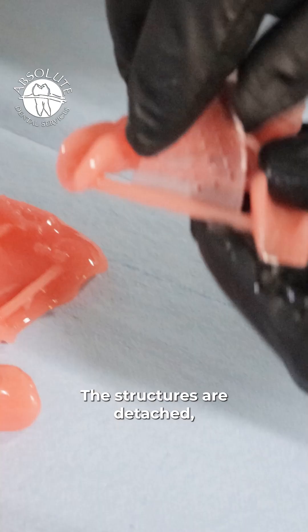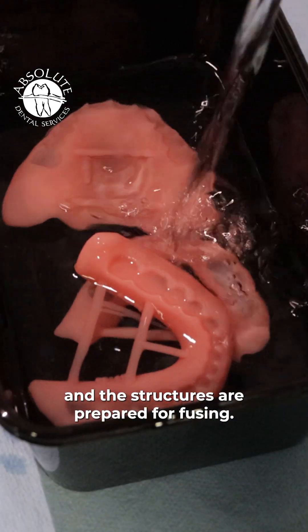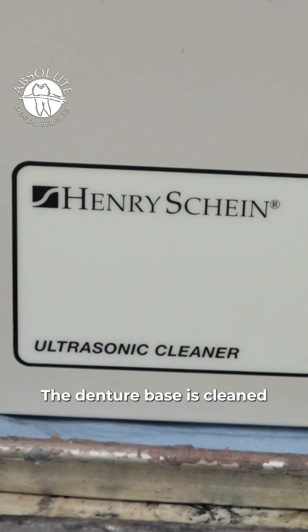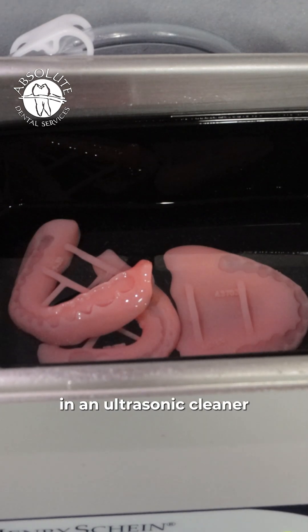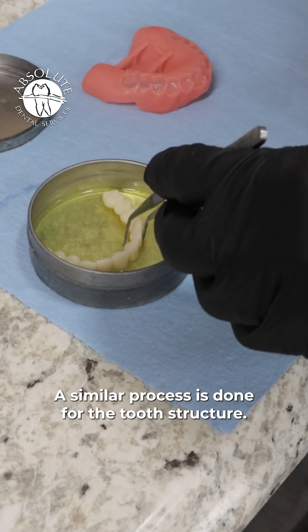The structures are detached, excess material is removed, and the structures are prepared for fusing. The denture base is cleaned in an ultrasonic cleaner and given a quick scrub. A similar process is done for the tooth structure.